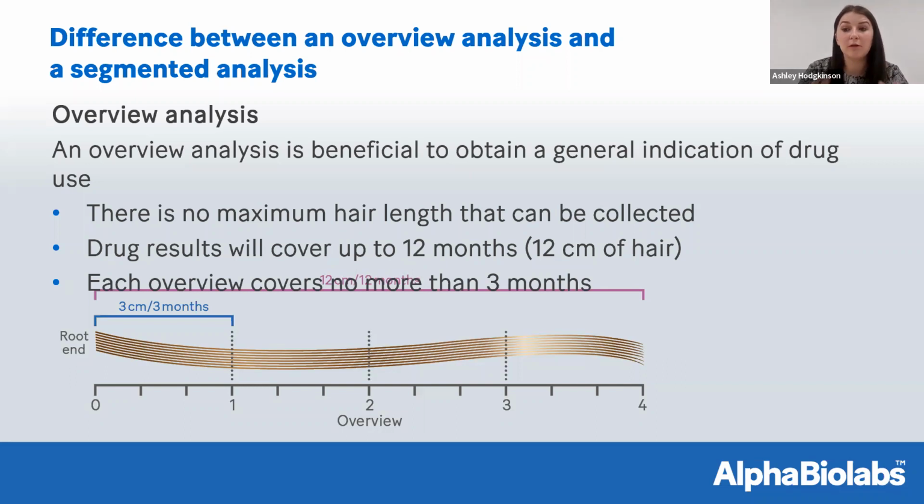So if, for example, you were representing myself today and I said I'd never touched the drug, there was no way that it would be found in the presence of my hair, then you may opt for an overview, knowing, based on what I've informed you of, that it's likely to be a negative result. So you don't need to look at each individual month because all months are going to test negative. And that's where you would look at using an overview for the analysis.